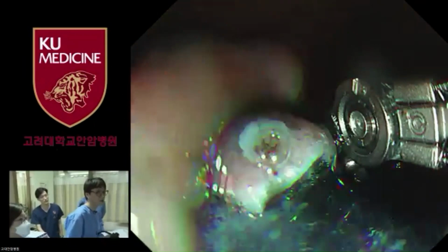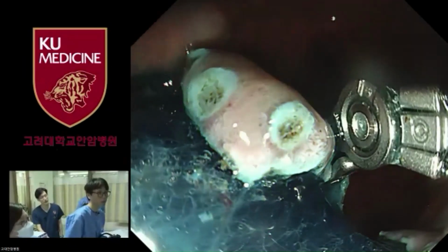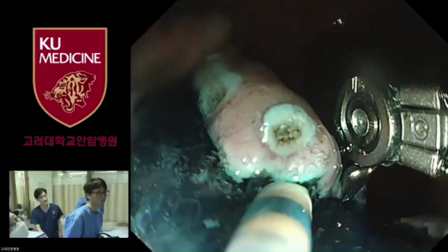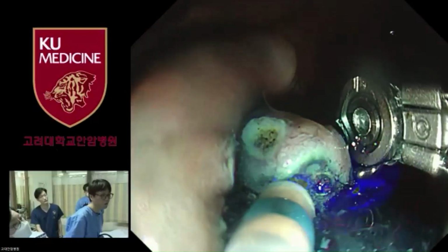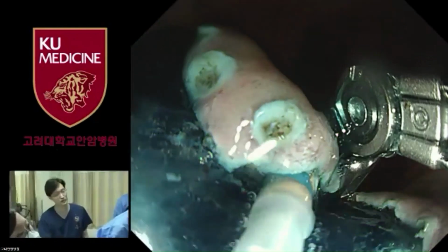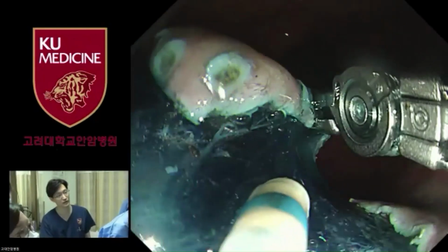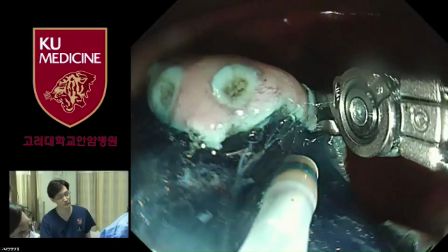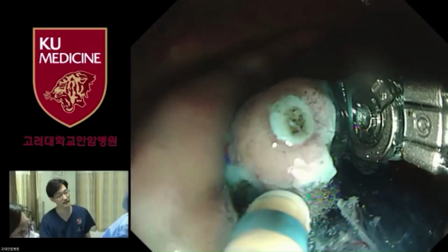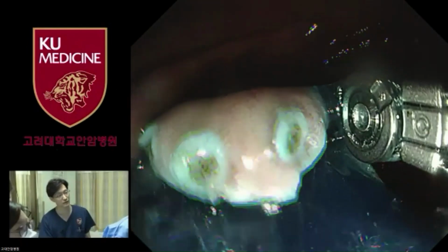When we compare the clinical outcome to the conventional gastric ESD, I think the dissection time is still similar, because we need some time to become familiar with this device's movements. So the dissection time is still not that short compared to the conventional ESD.